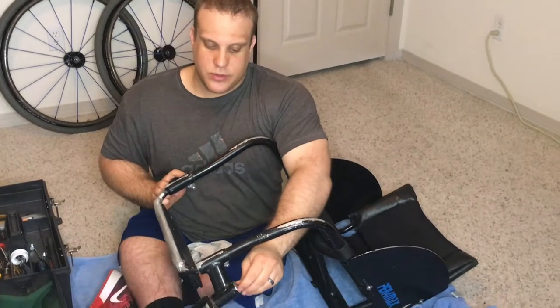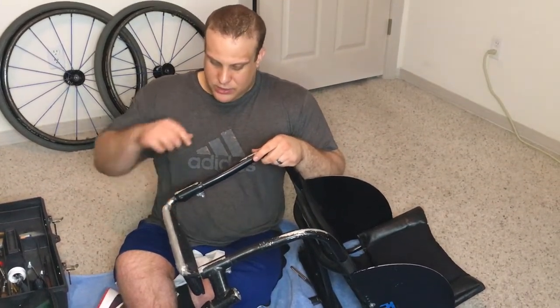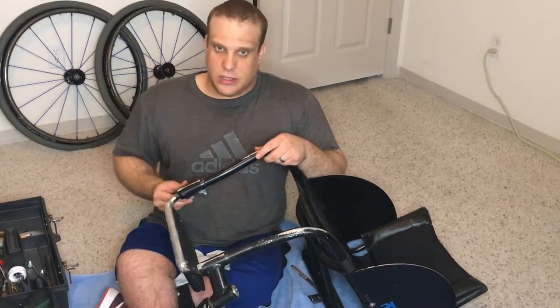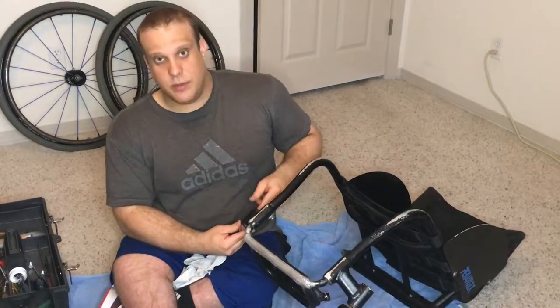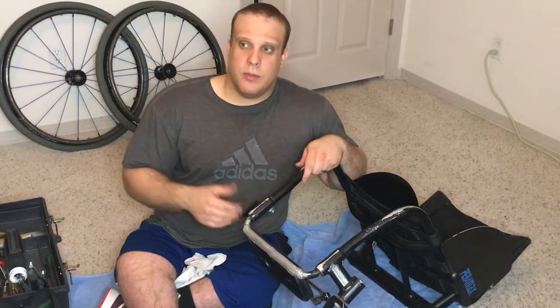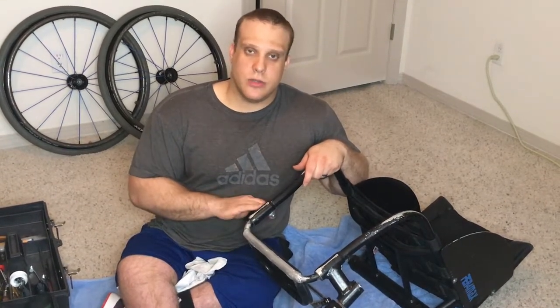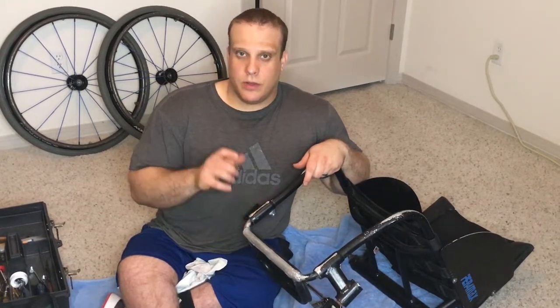The top of my caster fork housings are supposed to have little plastic caps on them, but I tend to lose them quite a bit. Because of that, there's a lot of sand and salt and stuff — especially up here in the winter — that gets into these. So my bearings go out a little more often than on some enclosed ones. I can show you another time how to do those. Some of the new Quickies have enclosed caster housings, and I think Lasher Sport has enclosed caster housings as well. It's a little bit more involved to do those, but still easily done.